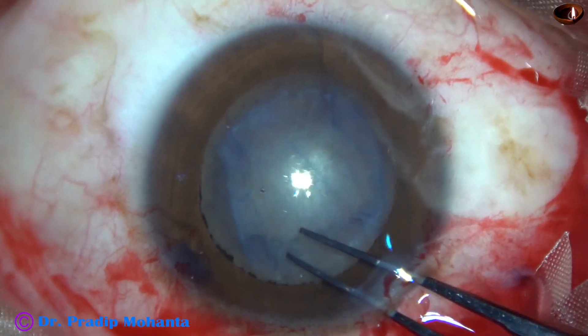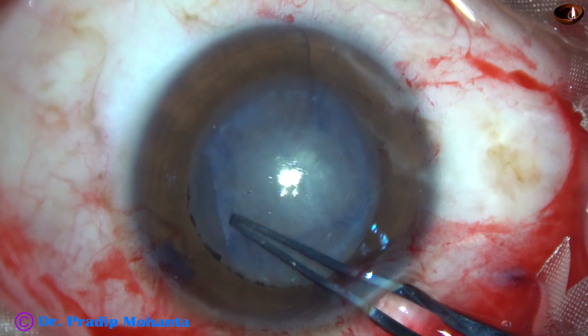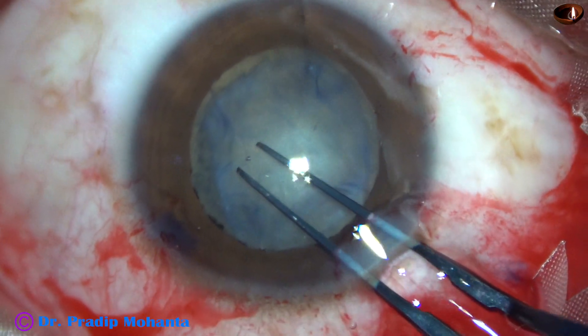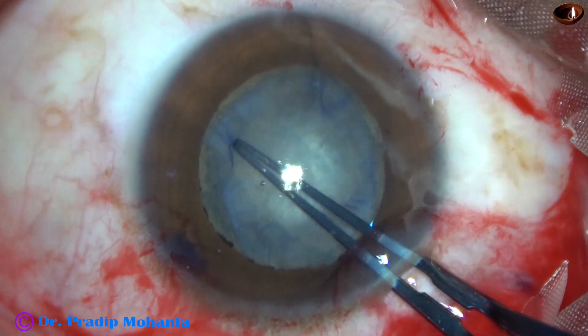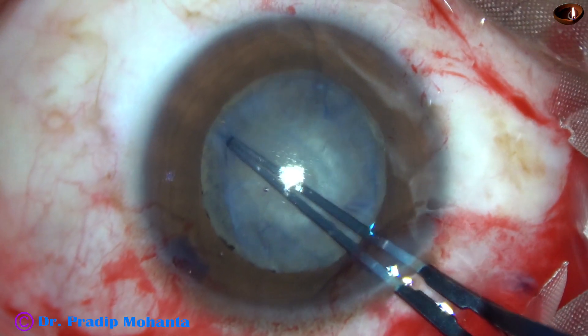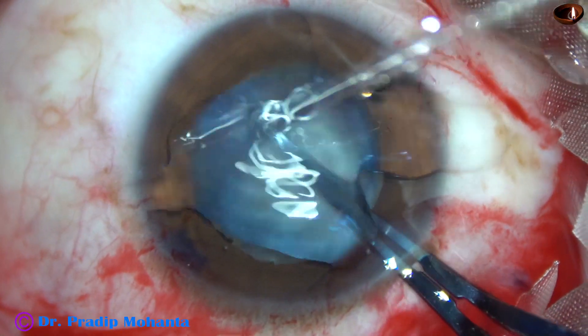Now my plan is to separate the capsule from the underlying fibrous tissue. I'm using the tip of the capsulorhexis forceps.